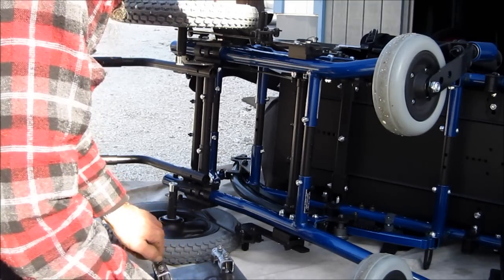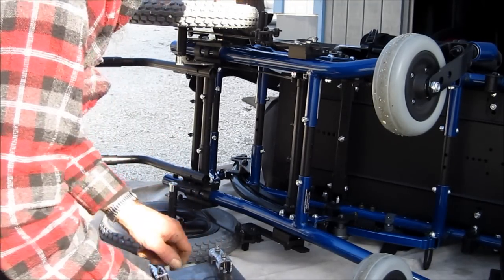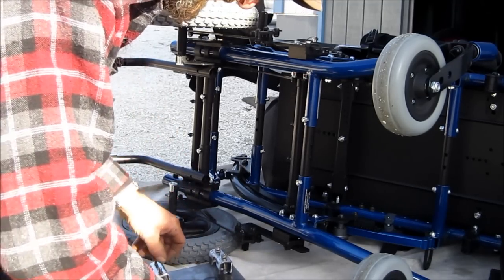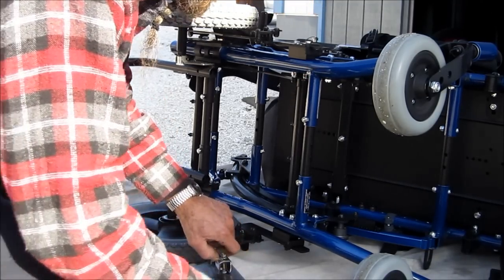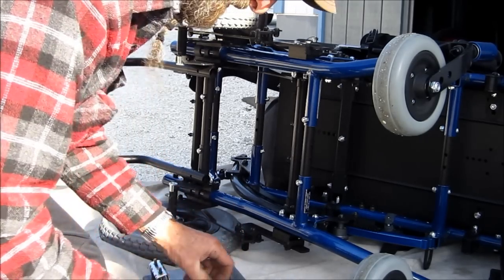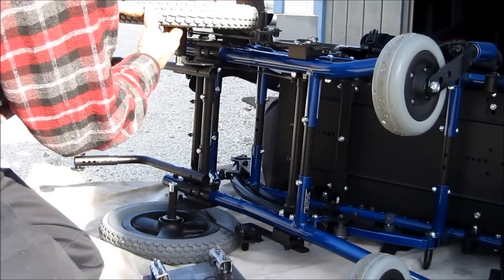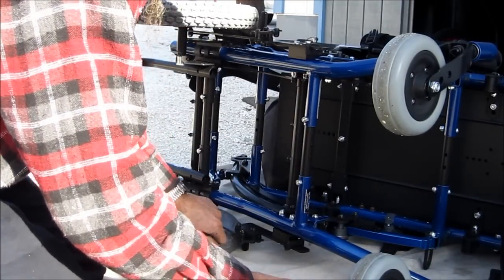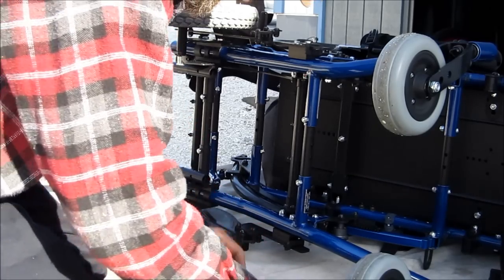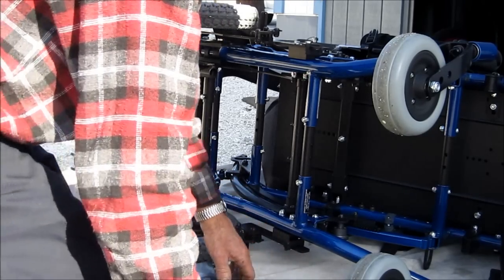We're going to go ahead and bolt the fixture that's going to mount onto the wheelchair first, then take it into the van with the other piece locked in. We're going to check our height — we want to give them the optimum amount of height. These are pretty hard tires, so I don't think there's going to be much squat with a lot of weight, but we want to fit into the middle of the design dimensions on that catch.